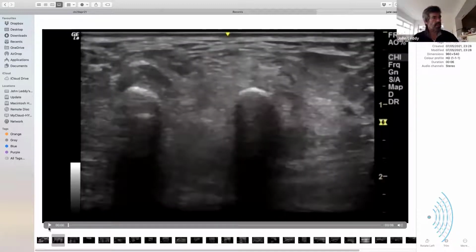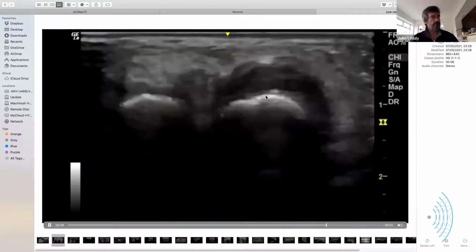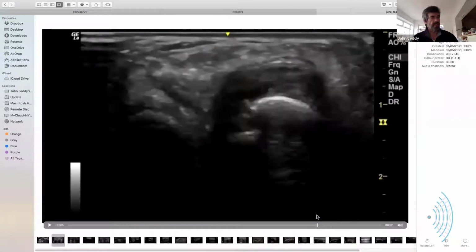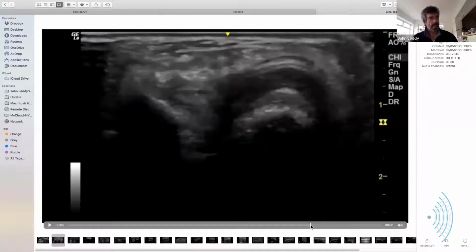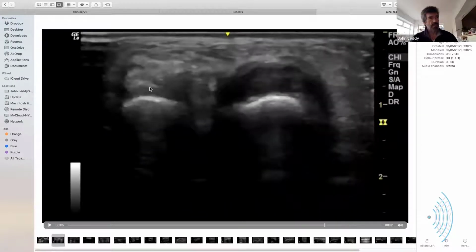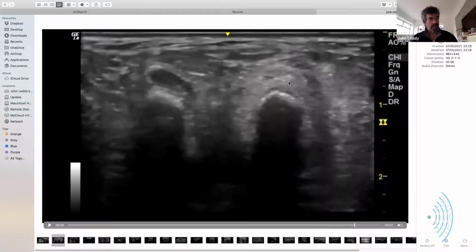This is one I think you'll have seen, because I put this one on Twitter. So this was a little bit of synovitis here, short axis on the second MTP joint. But what offended me is what it looks like just beyond it. This is the MTP joint of number 3, which isn't inflamed, but what happens afterwards, that goes to normal tissue. This side, when it goes away, goes to this bright tissue here.